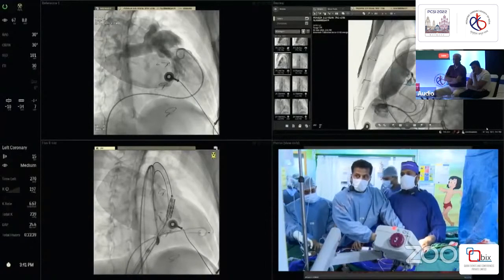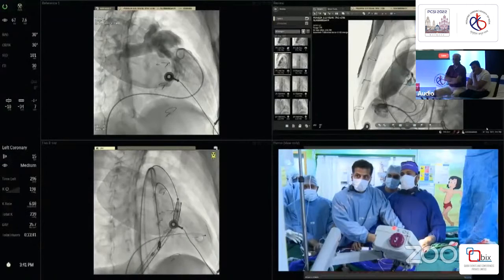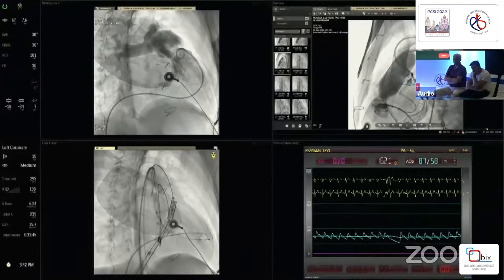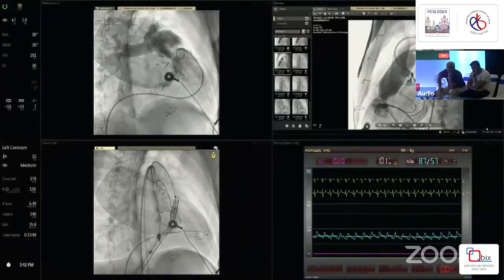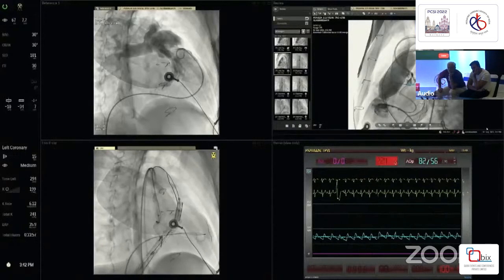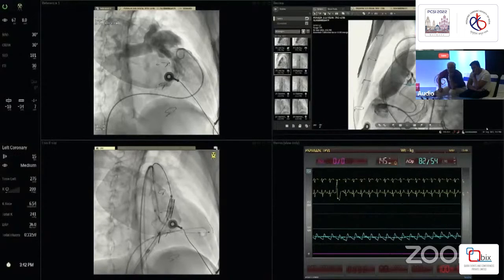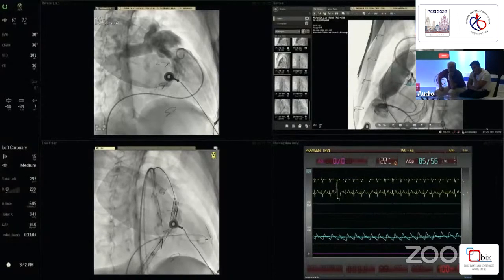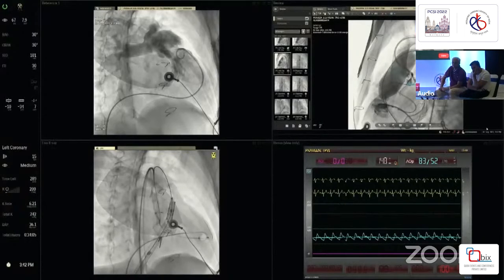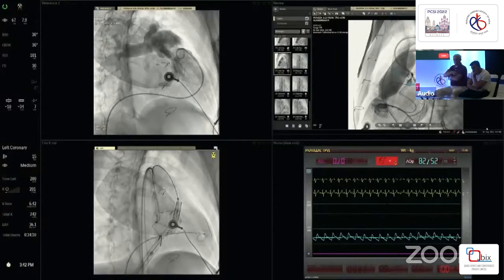So this is important not to forget. Coming, sir. Both wires are coming out. Pardon? I'll push the other wire inside. Push that wire. It's jammed. No, it's coming. Push the other wire inside. Okay, fine. But the other wire should be inside. Somebody turn it around. Yes. Okay, fine.